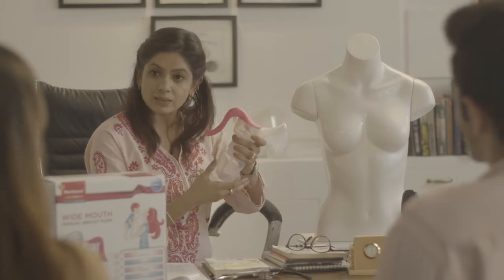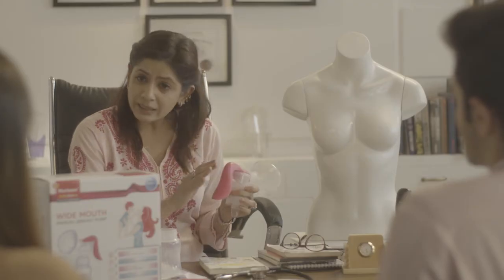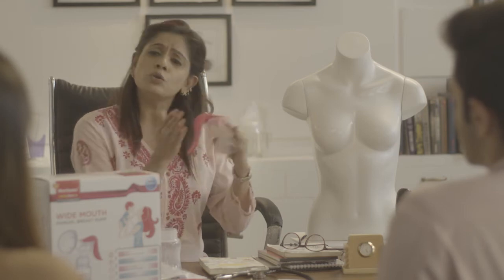Like this — you can adjust the handle as per your comfort. After you collect and store away the milk, switch to the other breast and repeat the whole process.